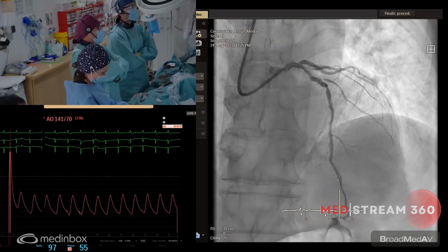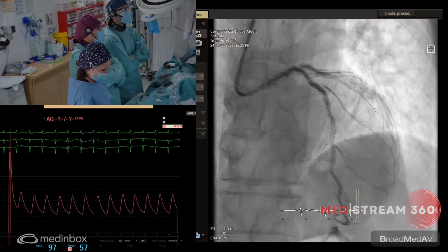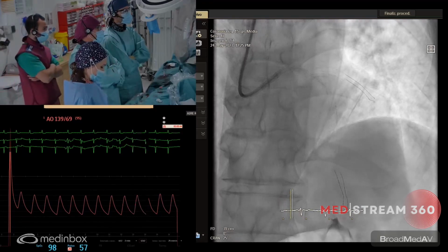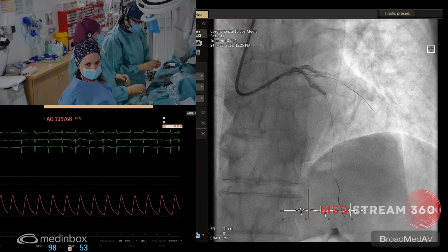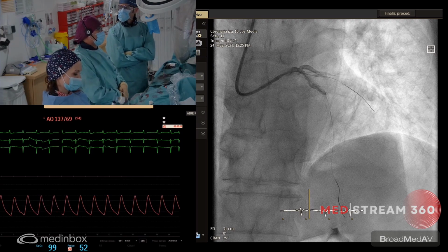Let's do a cine probably. Contrast, please. And with the cine, we can decide. The first diagonal is a little bit different in the ostium, but the flow is okay. Why don't we pre-treat with a drug-eluting balloon the diagonal we have, and then protect the third one?